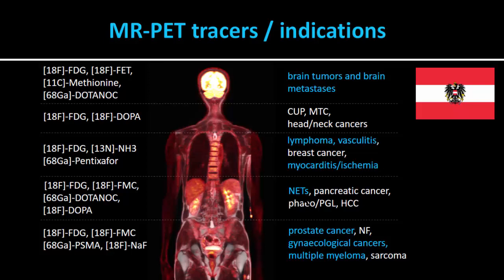Neuroendocrine tumors, of course, we have the DOTA peptide tracers that are extremely specific for this type of tumor. And then, of course, you have MR, which is vastly superior to CT in the liver, if you use contrast medium in particular, or DWI, because they normally metastasize into the liver first.